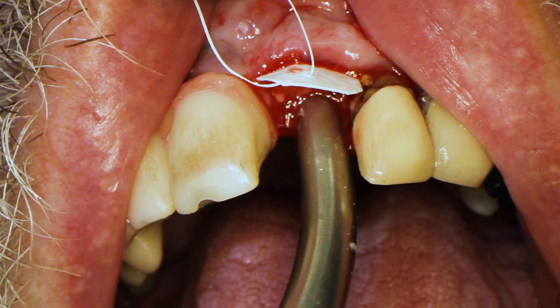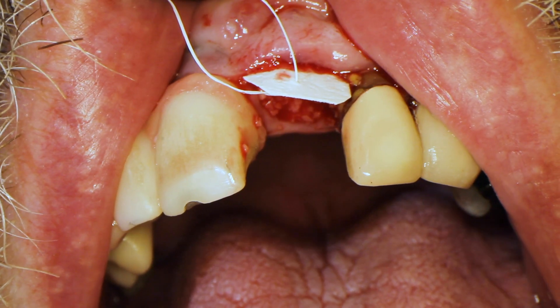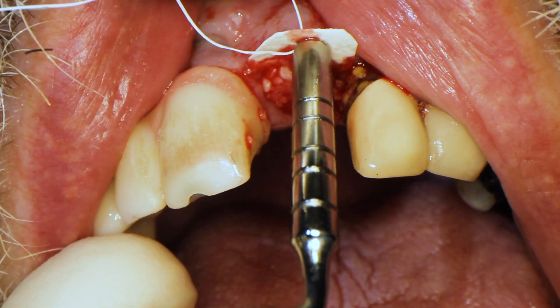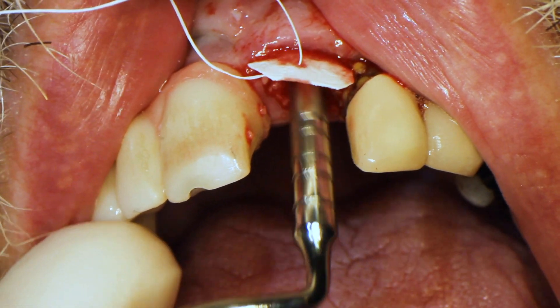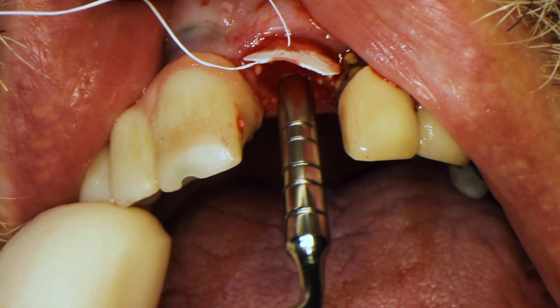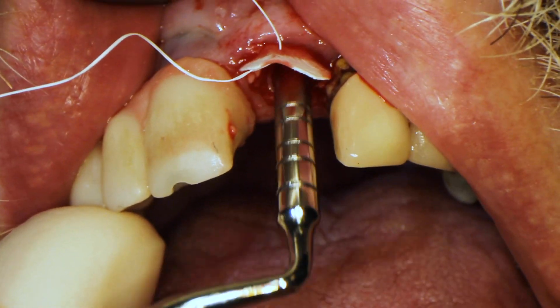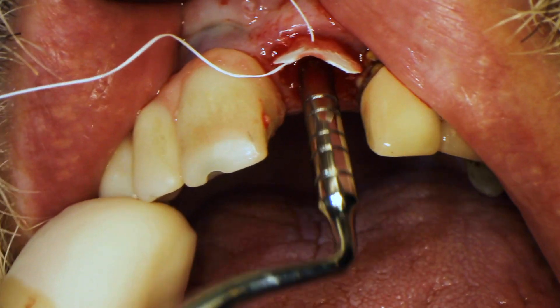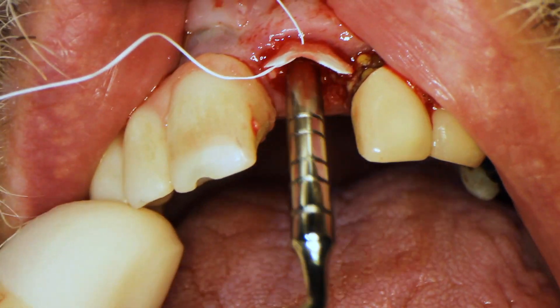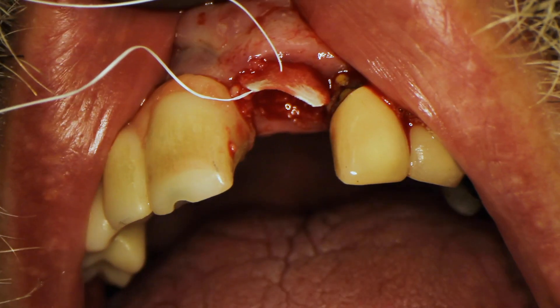Now I take my bone syringe to carry my cortical cancellous mix of bone and shoot it into the socket. Remember, I've been hydrating this bone since the procedure started — it's already hydrated for about 15 minutes. Then I take a little bone condenser and pack it into the socket. This fills the socket and also helps hold the membrane in place by putting pressure on it, pinning it against the wall.